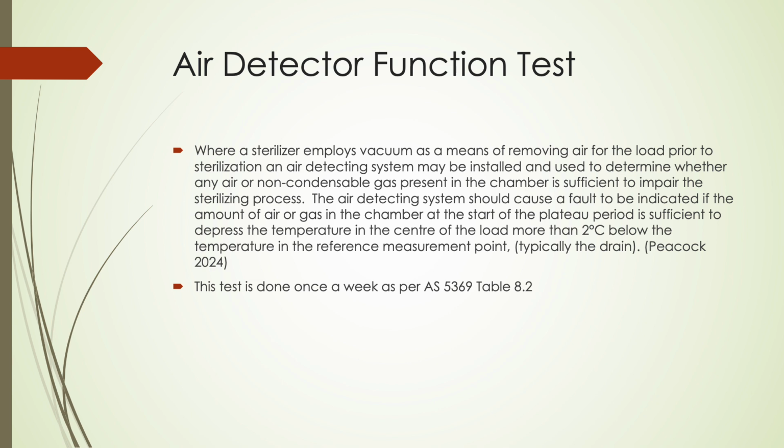This also indicates that the air detector system is working properly. The air detector test should be completed once a week as the standard's minimum requirement if the sterilizer is fitted with an air detector system.